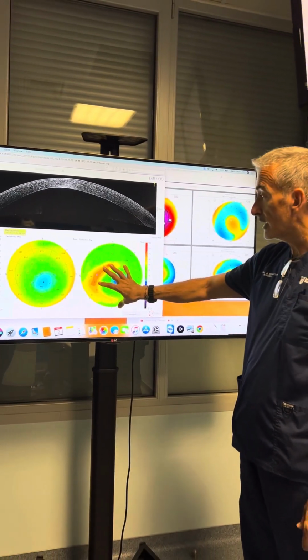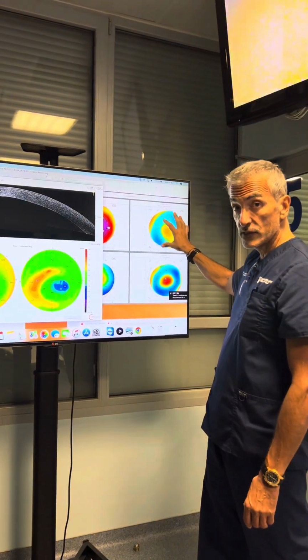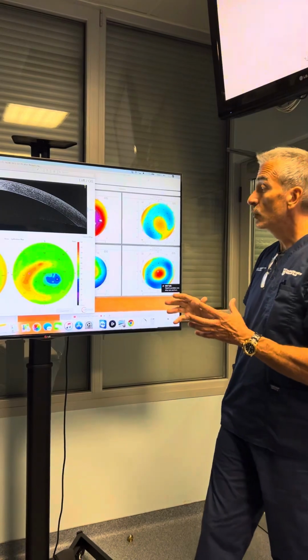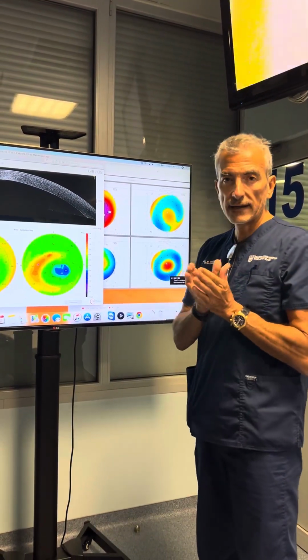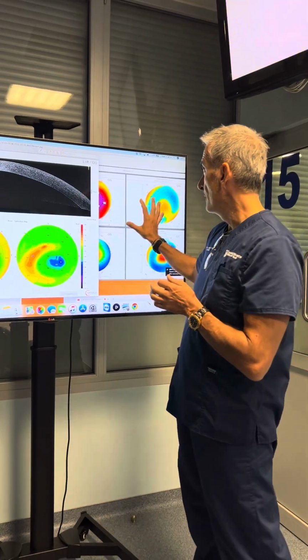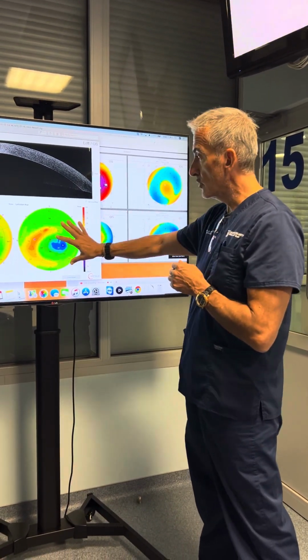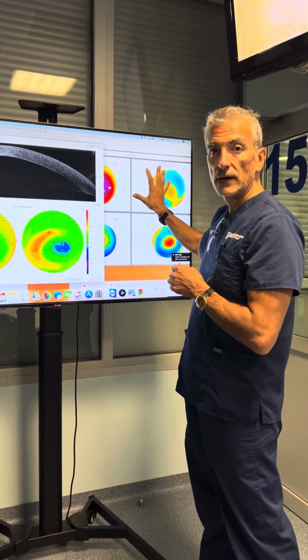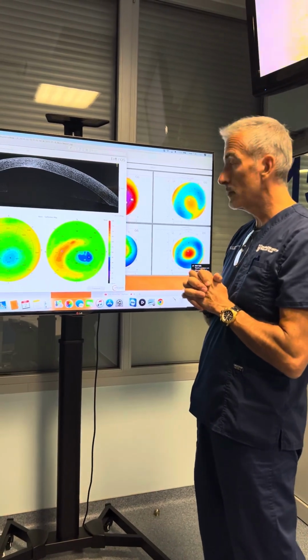The epithelial remodeling masks some of the anterior cornea manifestations of the cornea, and that's why we have advocated that the epithelial maps are a more sensitive diagnostic tool than the curvature maps, because in the beginning of the disease, the epithelial remodeling can mask the cone from all our topography or even tomography measurements.